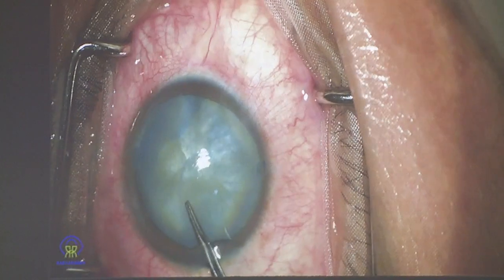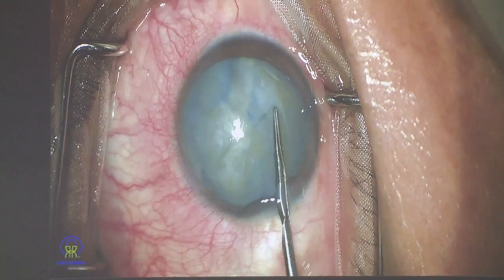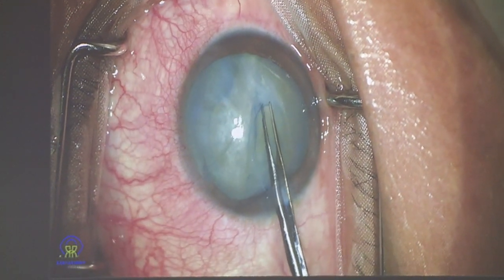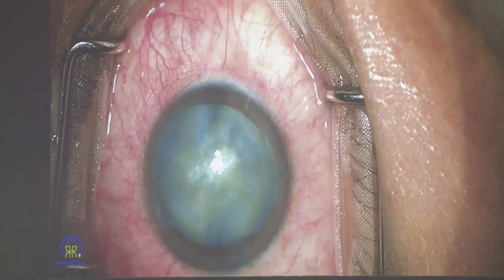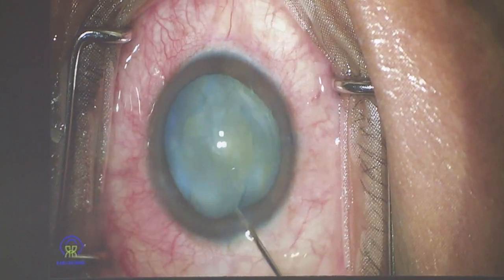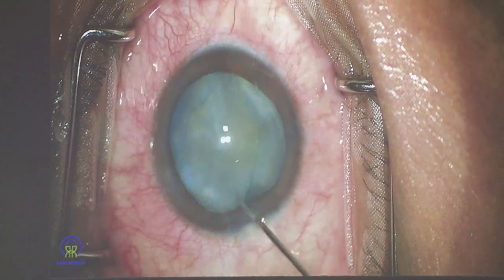This patient was selected for a premium monofocal IOL and didn't want to convert. So I gave a nick and continued with the case. I encircled and created a flap of whatever little available capsule that I had in hand, and then did a minimal hydrodissection just to ensure that the nucleus moves a fraction, which is enough for me to chop and remove it.